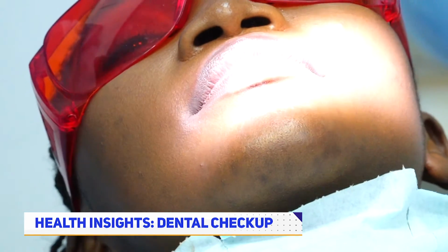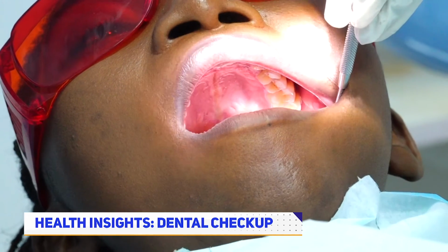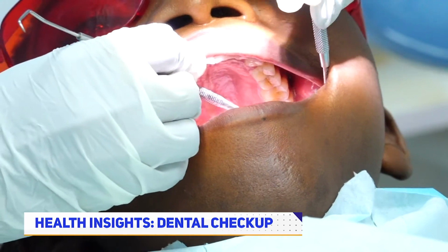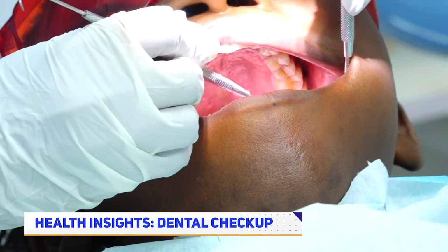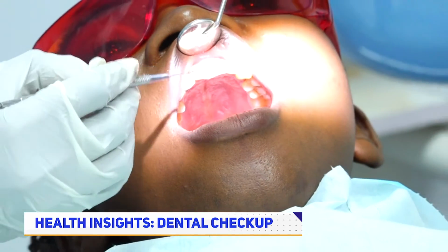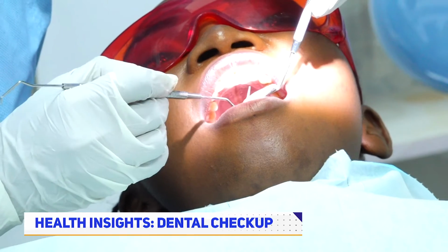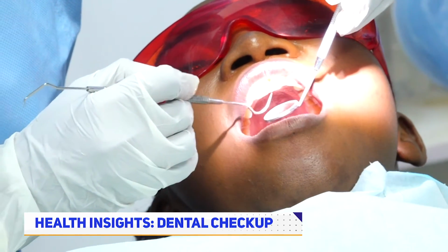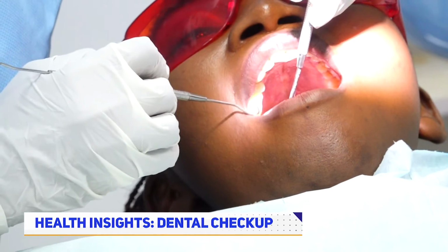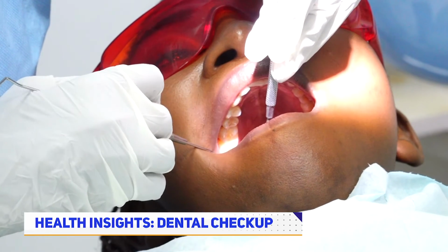So we'll take our mirror and our probe and use our mirror to look inside, reflected by the light. And then we'll use our probe to go through the teeth one by one to see whether there's any decay. And we look at all surfaces of the teeth. We look at the front, the inside, and the sides where the teeth contact, just to check if they have any cavities. We'll also ask the patient to report if she feels any pain or what we call tenderness if I touch any of the teeth.